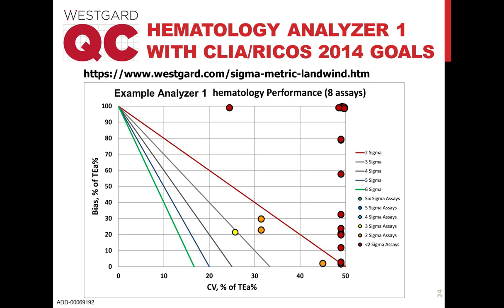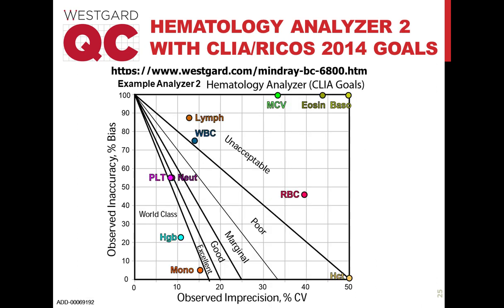And this is one of the things that we have to worry about as we see more and more new entries and new diagnostic companies coming to market with cheap hematology instruments. They may not be delivering good quality. Whenever it's too inexpensive, you have to worry they compromise their quality, and that's how they made a cheap instrument.